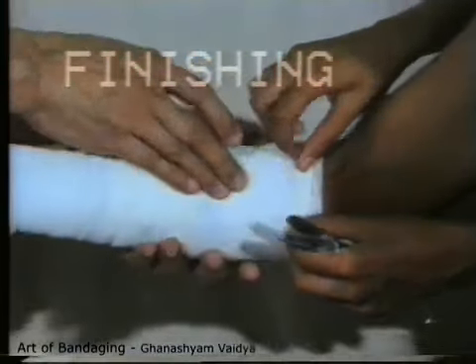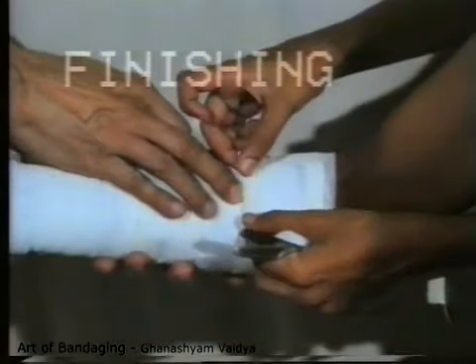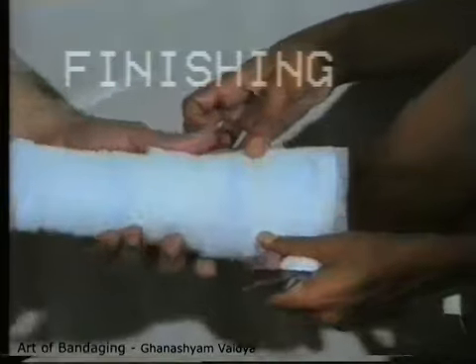Lastly, fix the end with strips of sticking plaster or safety pin or by splitting the end and tying. Two thin strips of adhesive plaster 2-inch long are fixed over the end of the bandage. A 6-inch bandage may require 3 strips. One end of the adhesive strips may be folded slightly to facilitate removal. Folding the end of the bandage also makes removal easy.